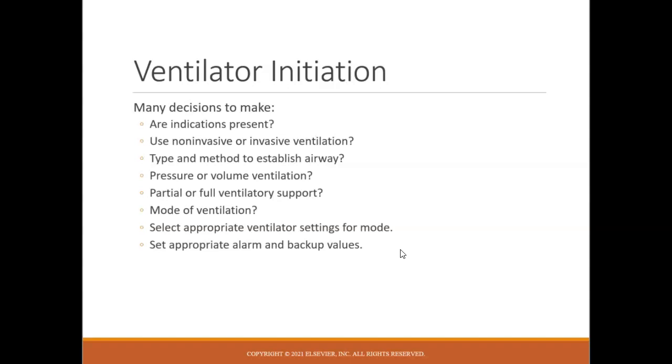If it was a patient who was, let's say, a COPD patient and whose issue was airway resistance, I would be picking smaller rates, right? Because I need to make sure I'm giving them adequate time to exhale. I'm going to be picking shorter I times, so faster flows. I'm going to be picking still smaller volumes, but not as small as with ARDS. And I'm picking smaller volumes because the more volume I put in, the more volume I have to allow time to get back out. So I'm still going to be picking small volumes, but for a different reason than in the ARDS patients.